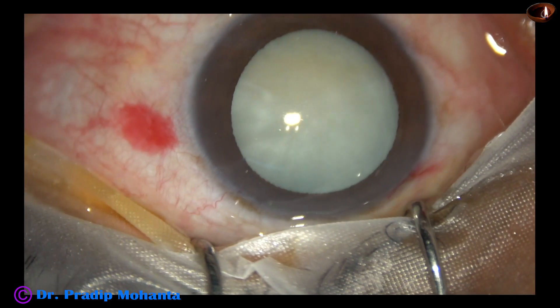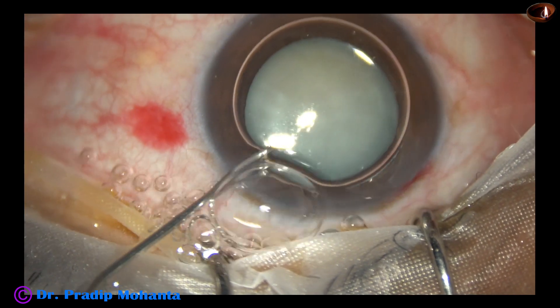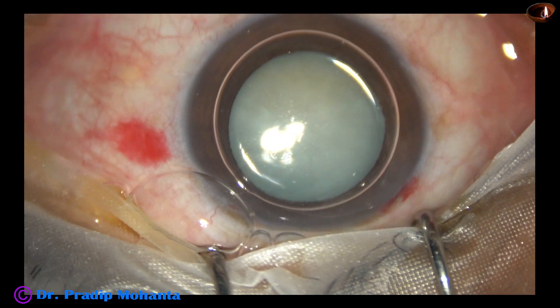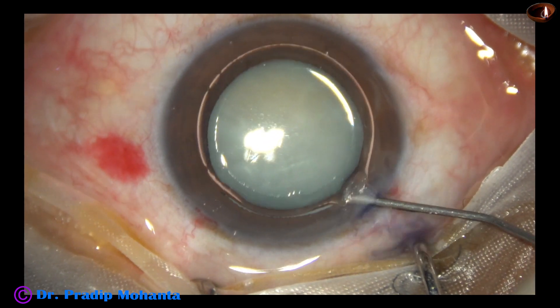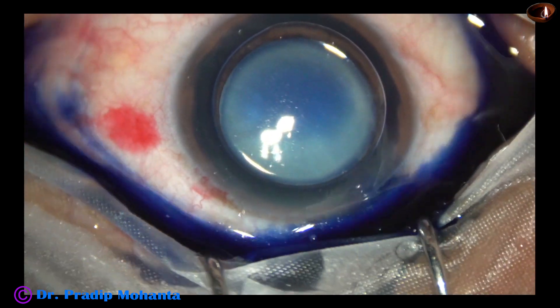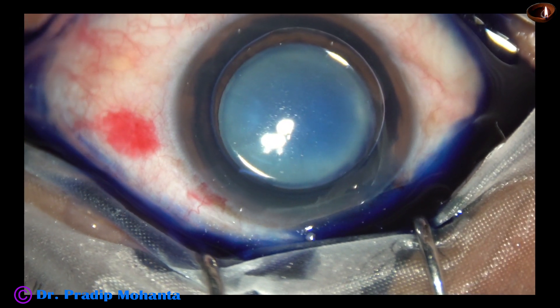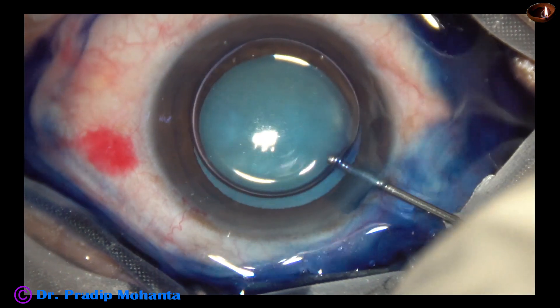Now the anterior capsule is stained with trypan blue dye underneath an air bubble. When we apply dye underneath an air bubble, the staining is very quick — it takes only 10 to 15 seconds for staining the anterior capsule.